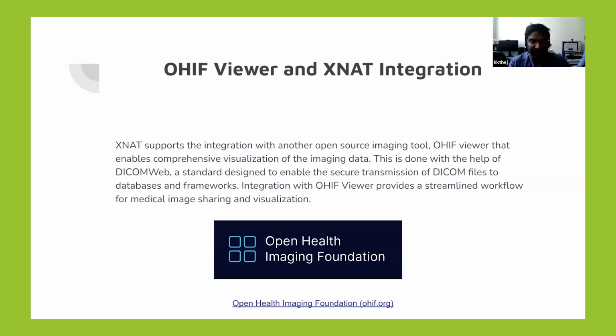It's connected with XNAT to view the images. This is the website of the Open Health Imaging Foundation group, and you can see how the OHIF viewer works. Also, how XNAT is integrated with the OHIF viewer.